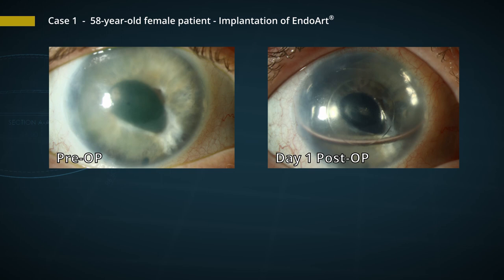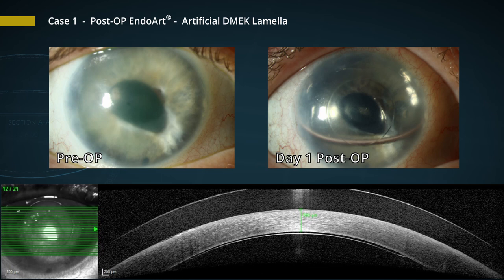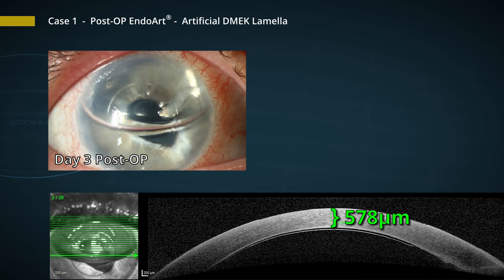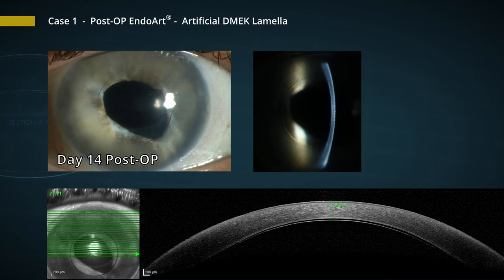Now let's have a look at the first post-op day. You can see already, compared to the pre-op, a much clearer cornea. Looking at the OCT, we see a decrease of corneal thickness down to 593 microns, which is already a good success. Three days later, the cornea becomes even clearer, with an OCT measurement of 578 microns. Two weeks later, we have a completely cleared central area of 6 mm, and now a normal corneal thickness of 495 microns.